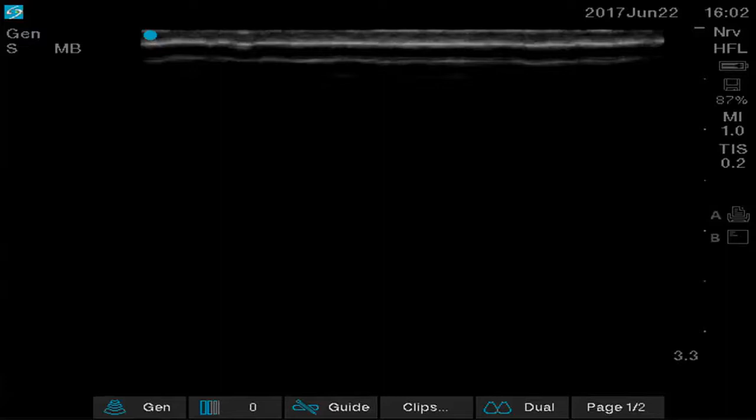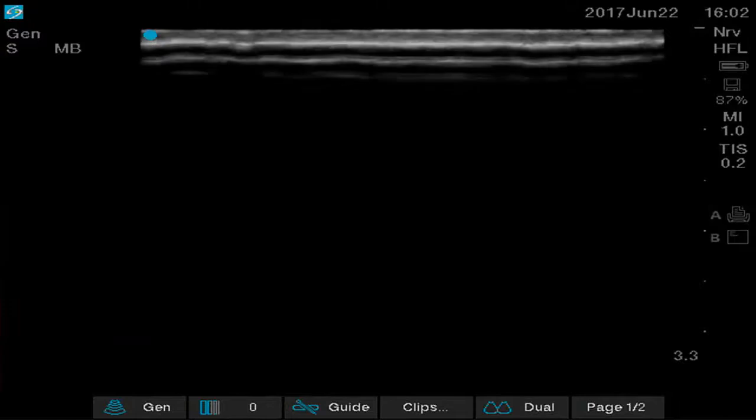Now, what I am trying to do is to recapitulate what we have done. I cannot reproduce the entire scanning. So let us, in a freestyle, flow through from top to bottom. First, let me scan the brachial plexus, then the lower limb, the femoral on the anterior compartment. Then the third session will be the sciatic nerve. Then the fourth, again I will come back to the front, like pectoral trunk blocks, pec 1, pec 2, and then serratus anterior, abdominal blocks. And then the last session will be thoracic paravertebral, intercostal, quadratus lumborum and lumbar plexus.